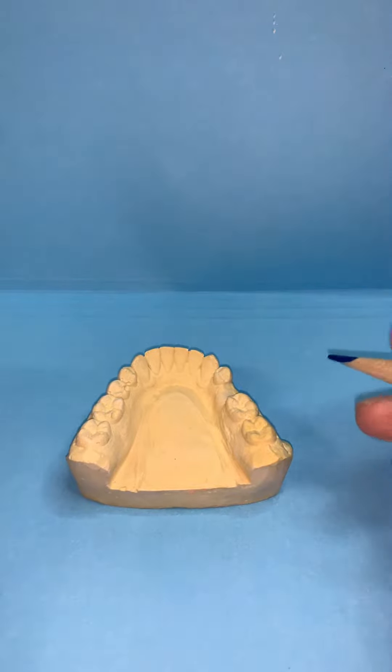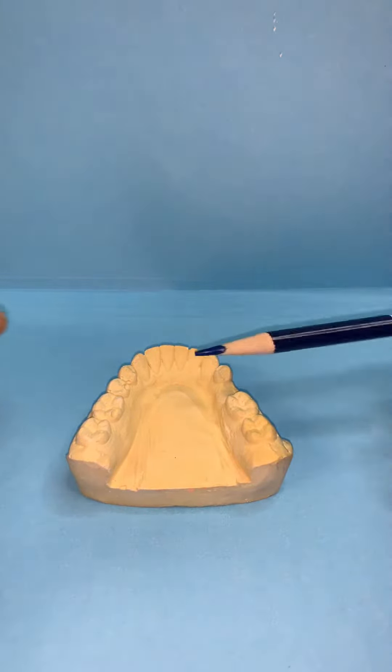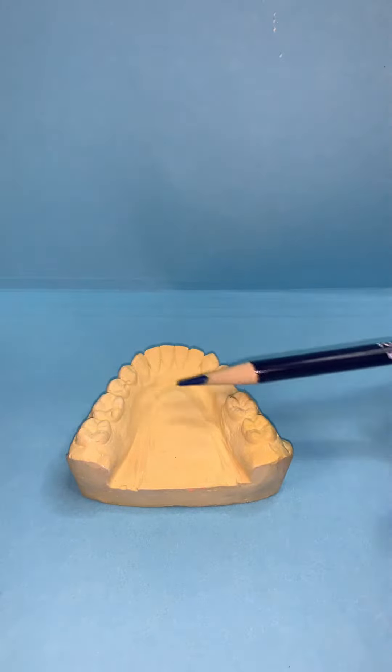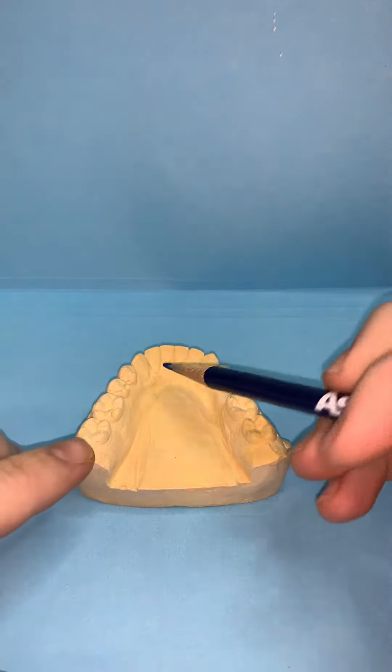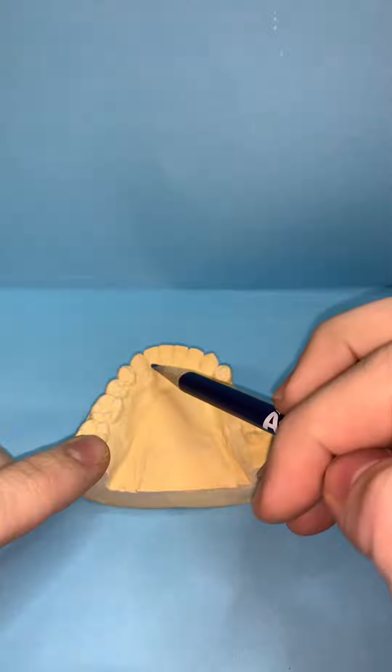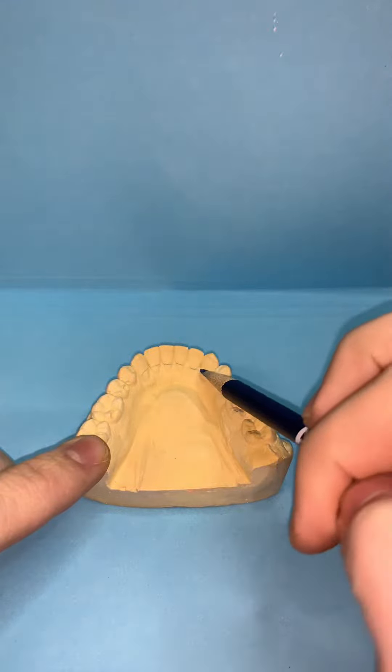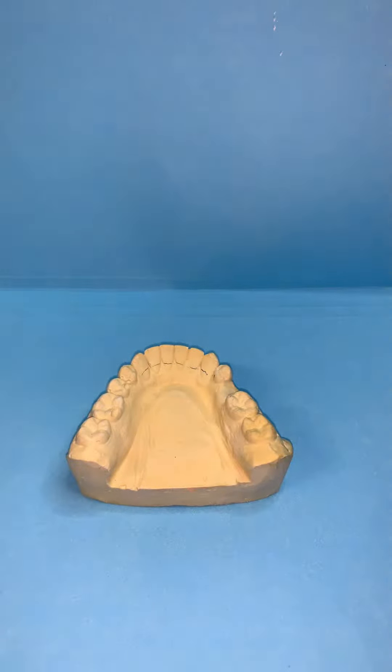To make a lower lingual holding arch, we would band the two first molars. Then you want to make sure when we bend our wire, we're touching the cingulums of the anterior teeth.